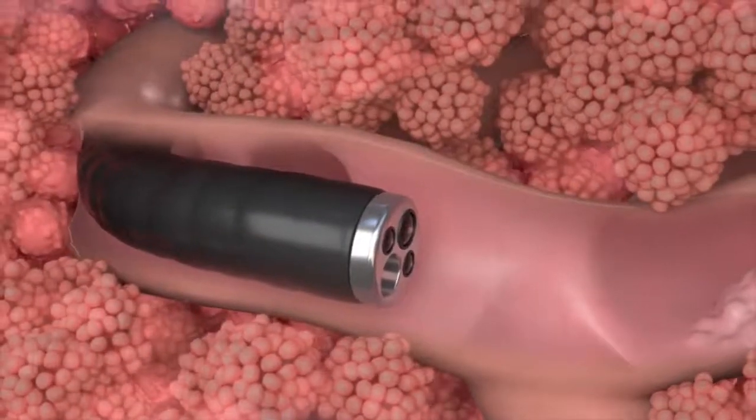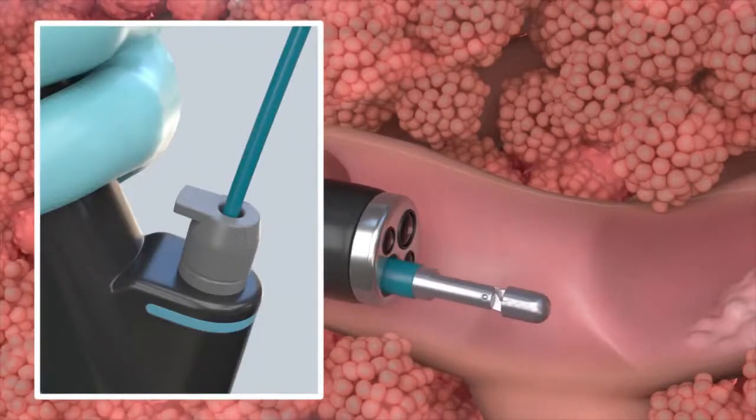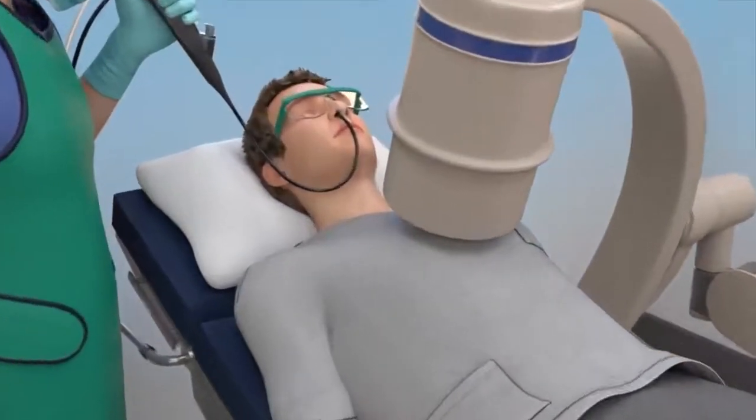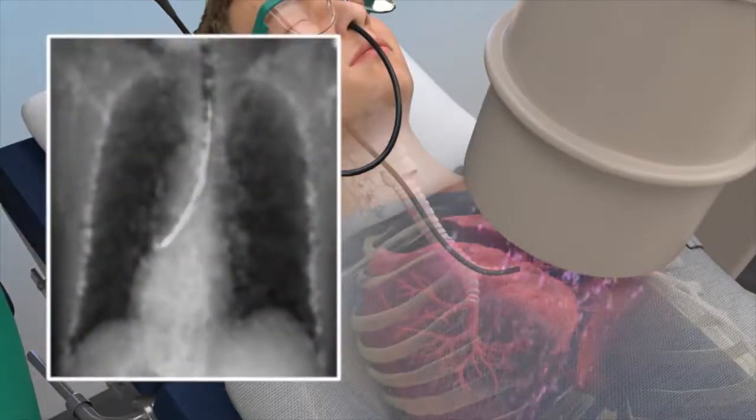Biopsy tools are gently passed through the bronchoscope to reach and view abnormalities. A live x-ray called a fluoroscope is used to watch the biopsy tools reach the lungs' air sacs.